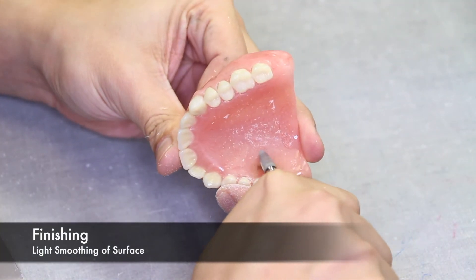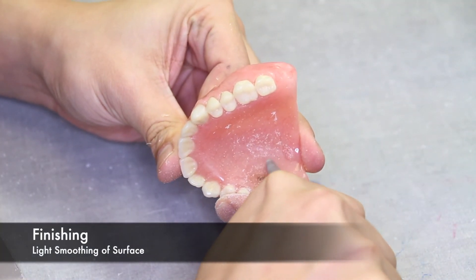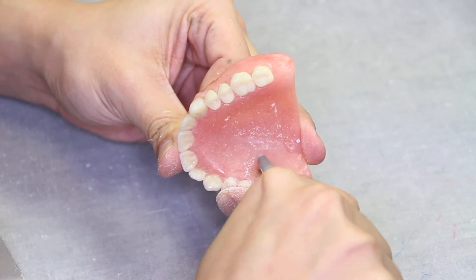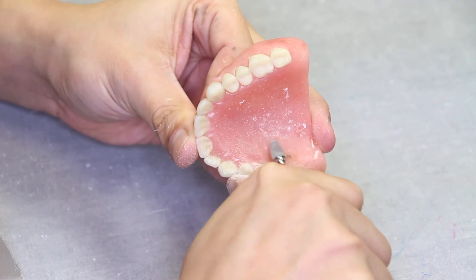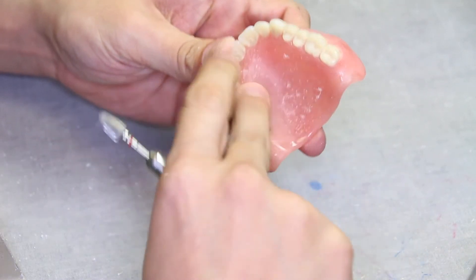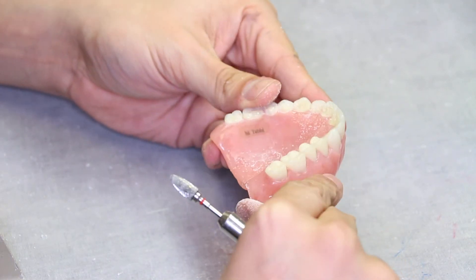Once the time has elapsed, you can retrieve the denture from the pressure pot and finish the surface with a carbide burr. When removing too much, you risk hitting the ID tag. Not enough, and there could be too much acrylic, which would be uncomfortable for the patient. You want to be sure that the name tag is legible.